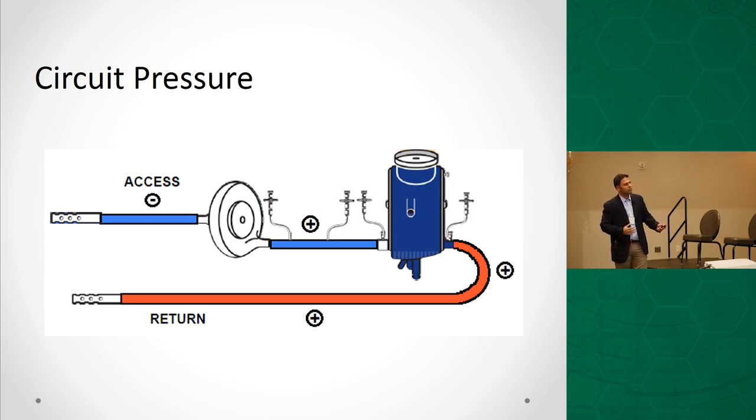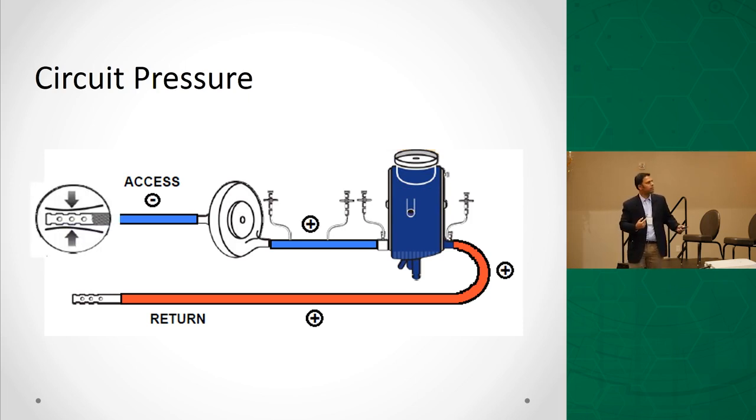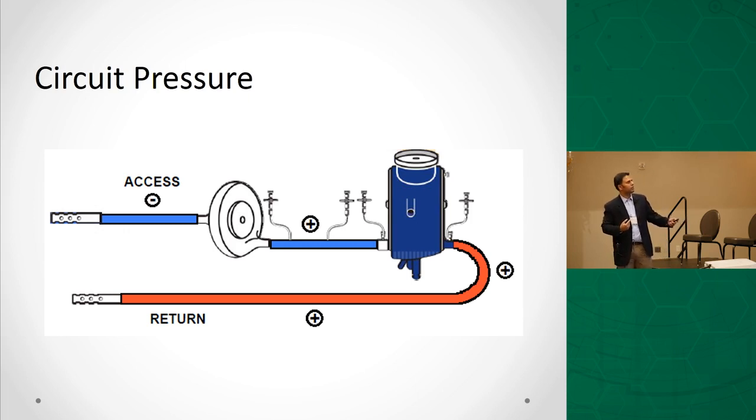So this is the pump. Just before the pump is the pre-pump. That is a negative pressure, so blood is being sucked in. And just immediately after the pump, you have positive pressure. Then you have the oxygenator, and everything is positive. Now let's see here. What if I have some kind of Luer lock here, and I accidentally open it? What's going to happen? It's a negative pressure system. Air is going to go in, right? So very important to know that this is a negative part of the circuit.